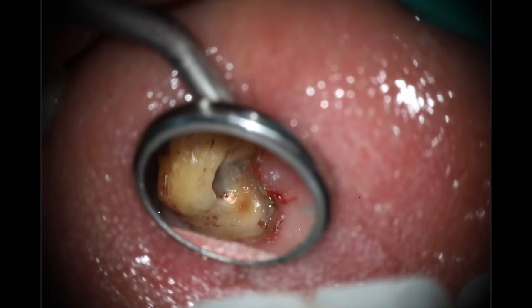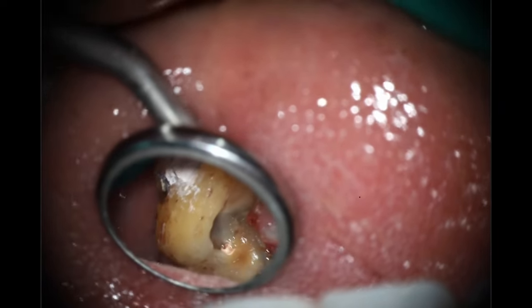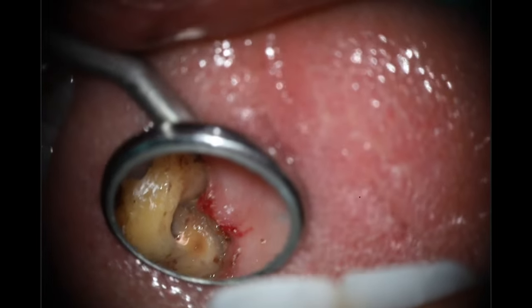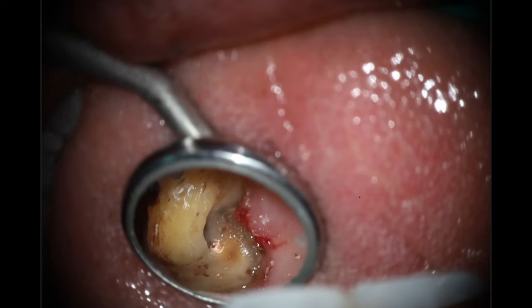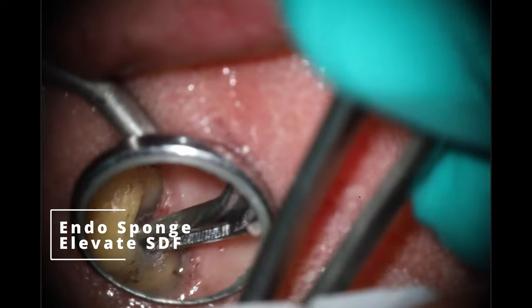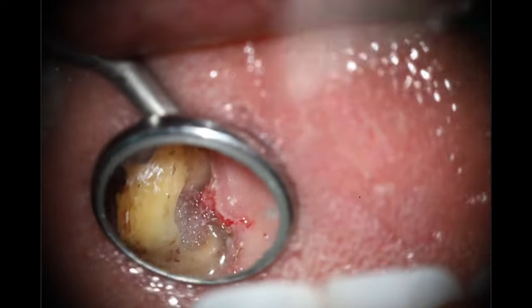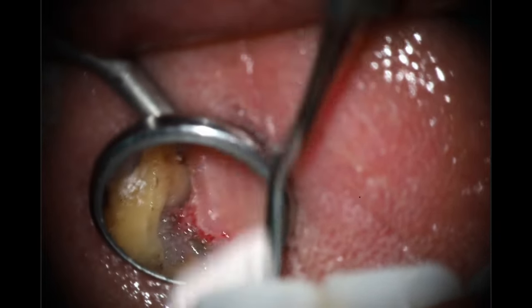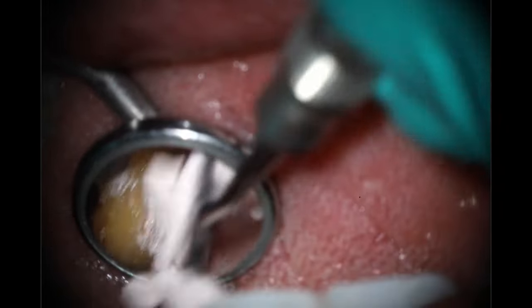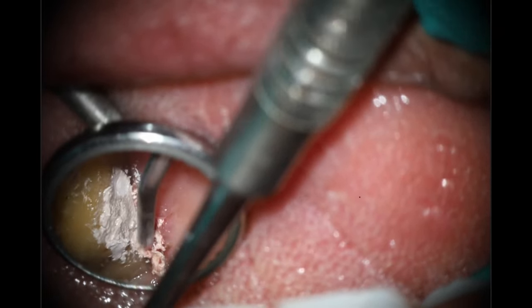You can see a little bit of the staining there — I don't want to remove it, it's not soft. So I want to set this tooth up for success, and how I did that is I used silver diamine fluoride. I absolutely love this stuff — it works fantastically well. What I did is I soaked one of my little endo sponges in there. You can see the blue — that's what the SDF looks like. And I'm going to be packing it in there, so over the day — because she was going to go see the dentist the next day — that silver and fluoride is going to soak into that tooth and help create a hopefully impermeable barrier to caries. Go over with the cavit, smooth it out with a glick, and then a wet cotton pellet just to make sure it's as perfect as can be.